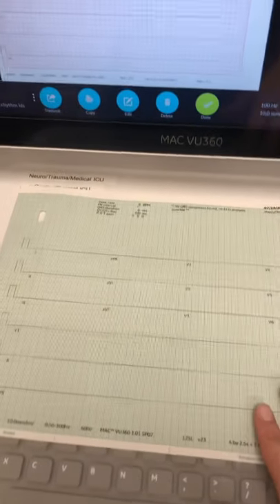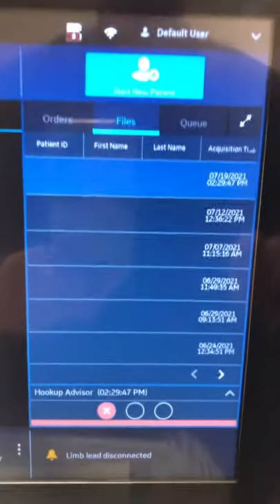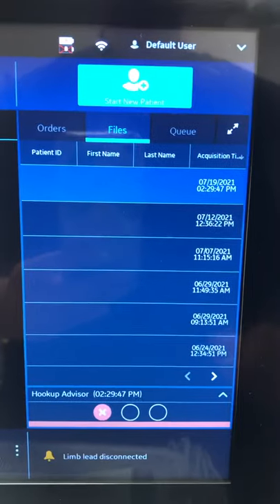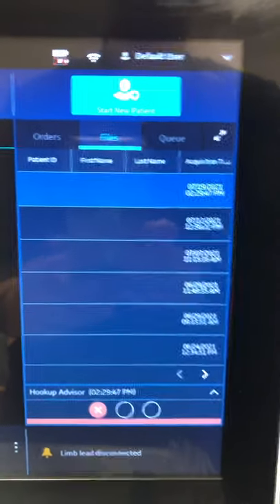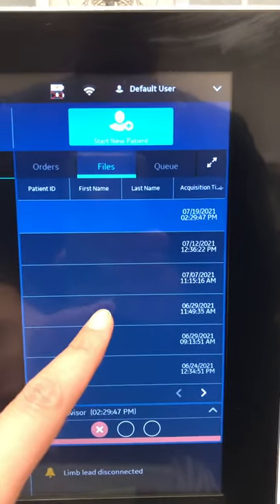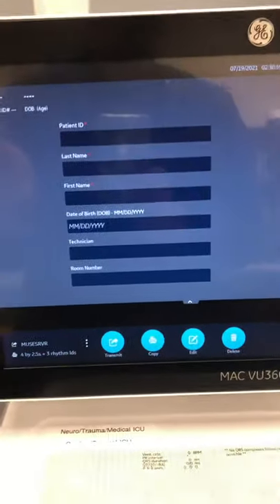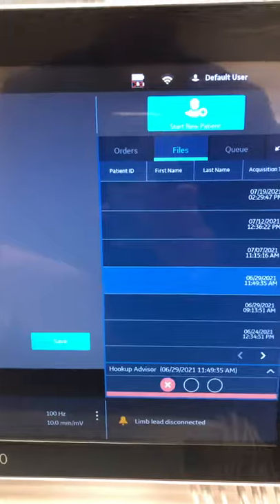Remember, we have the physical EKG, but we also need to make sure it transmitted to cardiac testing. Come back to the screen and on the right side you'll see Orders, Files, and Queue. Under the Files section, if you see your EKG sitting there, that means it hasn't been transmitted. The biggest reason an EKG isn't transmitted is missing patient information. Click on the EKG in the file list, it brings up that specific EKG, and you can go in, insert all the patient information, then hit Transmit. As long as it drops off the file list, it transmitted to cardiac testing and you're done.